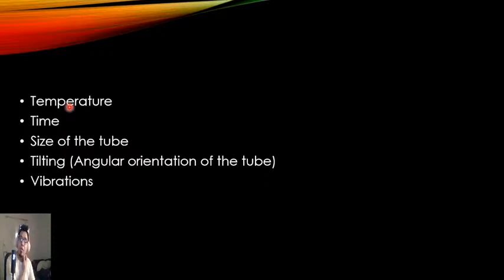Right? So obviously, if there's vibration in a specific surface, it's going to result in a falsely increased ESR value. All right. So be mindful of the questions. They might put it in a question related to ESR in this format.